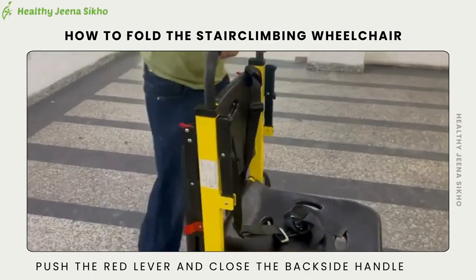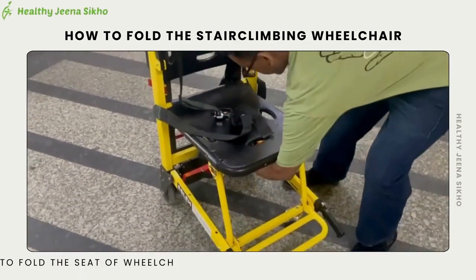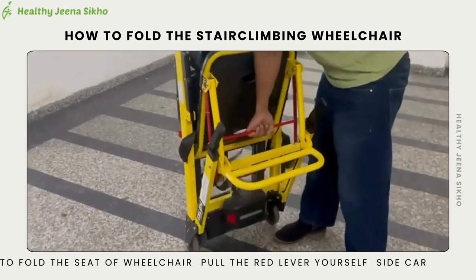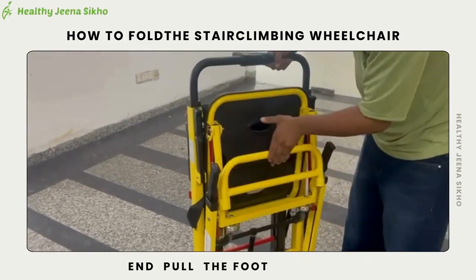Push the red lever and close the backside handle. To fold the seat of the wheelchair, pull the red lever on your side carefully, and then pull the footrest.